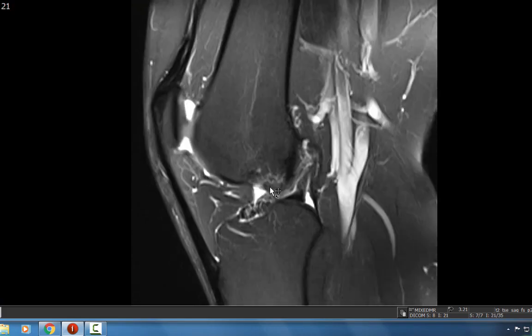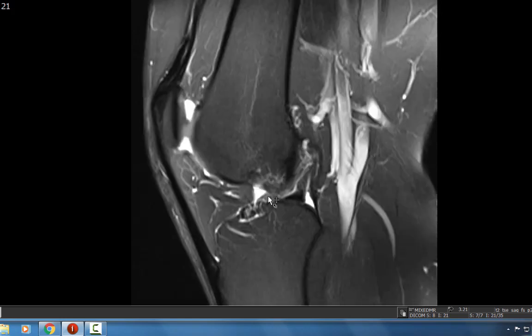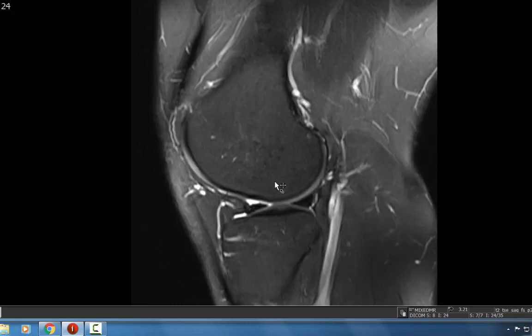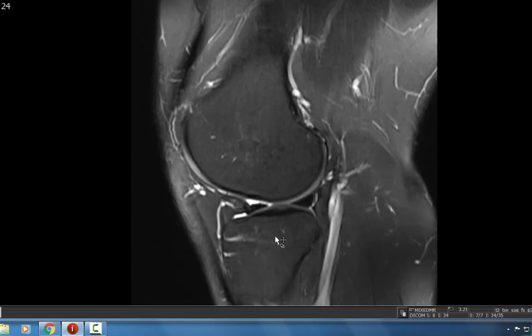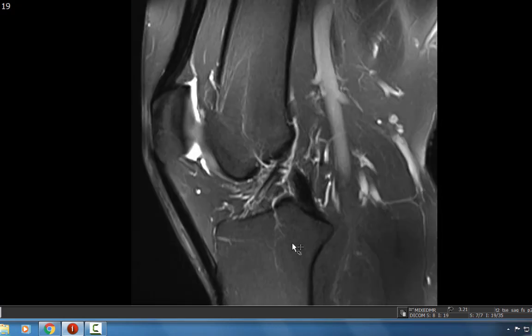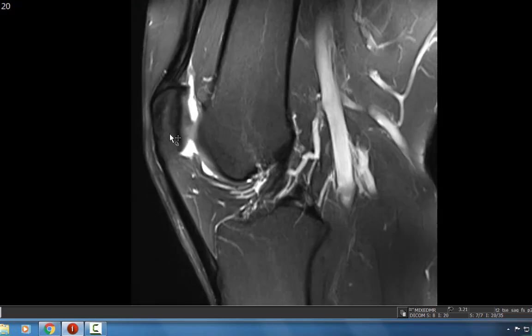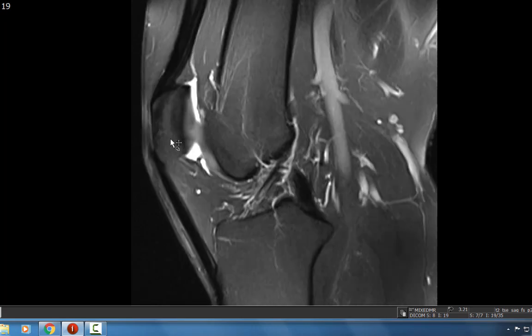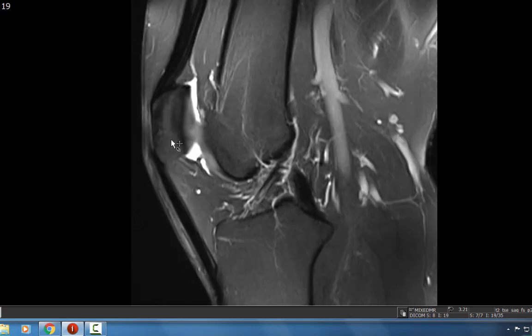I look then at the lateral compartment to see if there's any marrow edema. The marrow looks nice without any T2 hyper-intense signal to suggest marrow edema within the lateral femoral condyle, lateral tibial plateau, and the proximal fibula. I also scrutinize the patella to make sure there's no marrow edema, and there's no marrow edema whatsoever here.